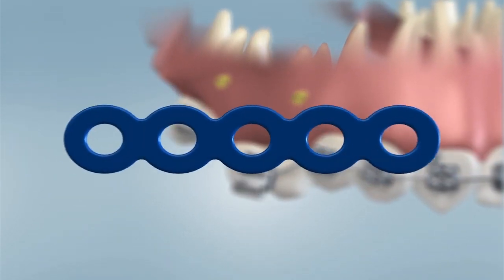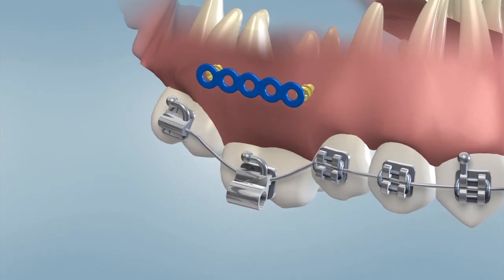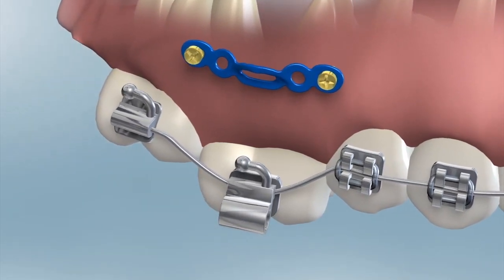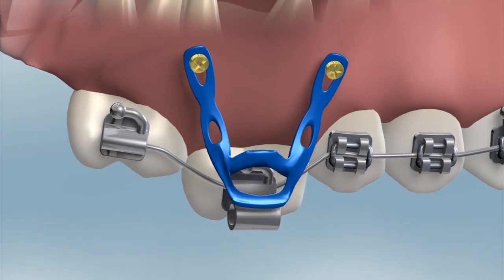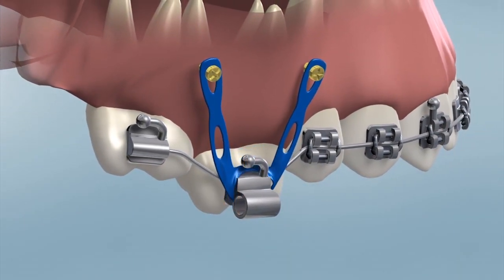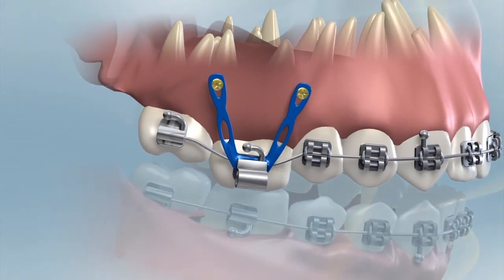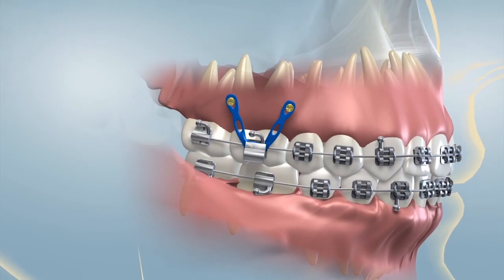A TAD is used in a situation where a solid anchor is required for the orthodontist to achieve tooth movement. TADs can also be used for patients who are missing permanent teeth. The benefit of a TAD is based on the basic law of physics — for every action, there is an equal and opposite reaction. In the mouth, when we put a spring or rubber bands between the teeth, they both will tend to move. The ability for teeth to move through bone over time is what allows us to move teeth with orthodontics.